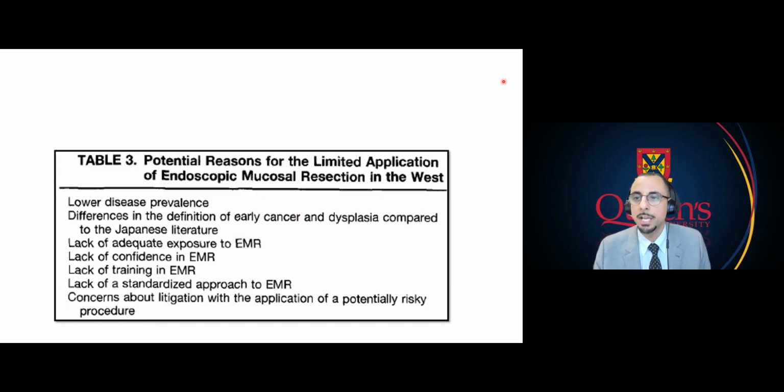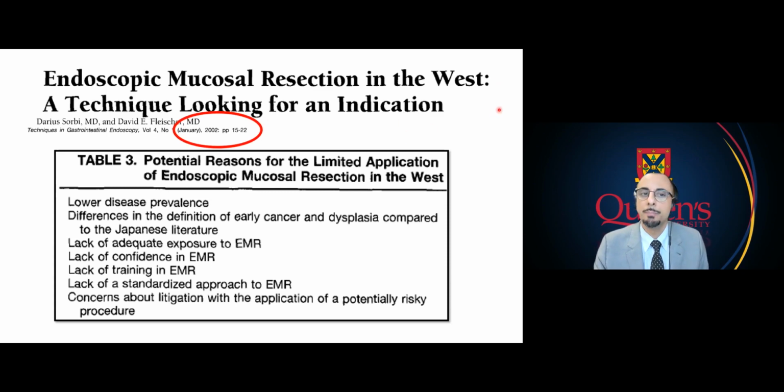However, this was actually what was said about EMR in 2002. This was out of a paper explaining why EMR is not going to take off in the West, and that we're really just looking for an excuse to do it. So this was in 2002. EMR is now done widely in academic and non-academic centers and has really become the standard for, as I mentioned, superficial small cancers or low-grade lesions.